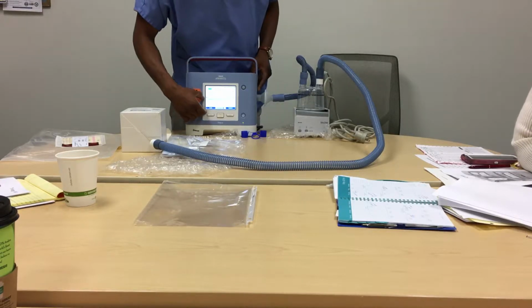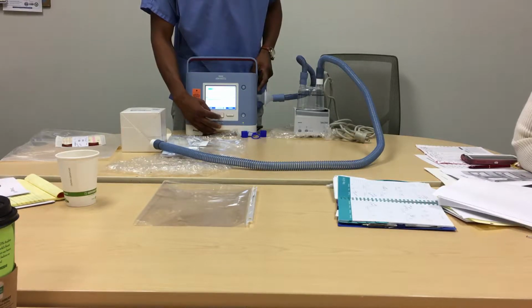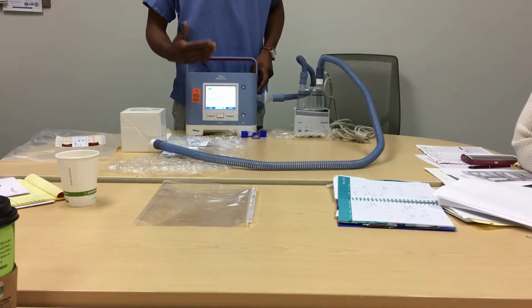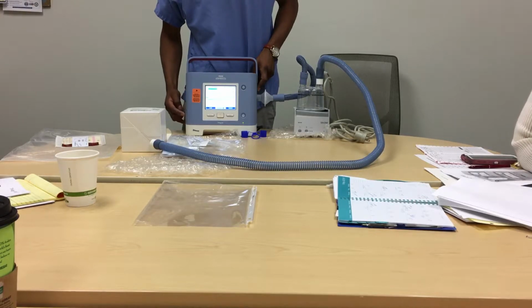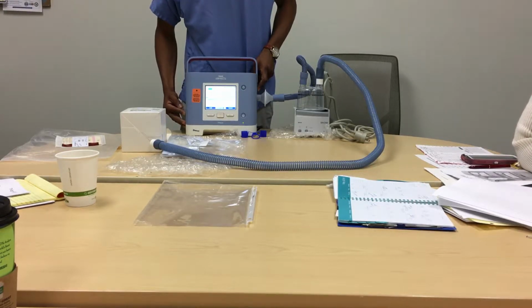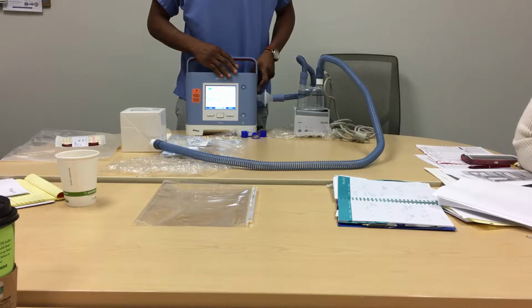The bottom part of your screen walks you through the settings, the alarms, and the options. It permits you to take out the SD card, which is to the side here. When we typically do event checks, we pull the card out just to see what they are doing. Most doctors are particular about that.